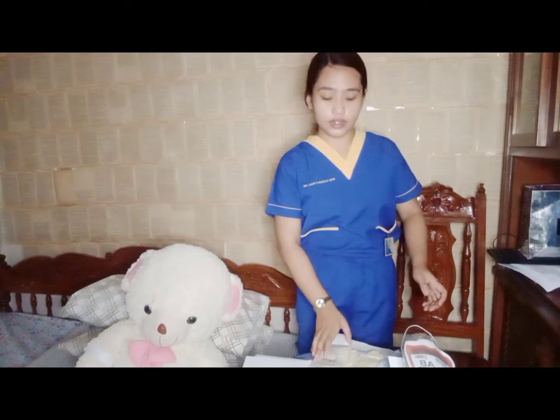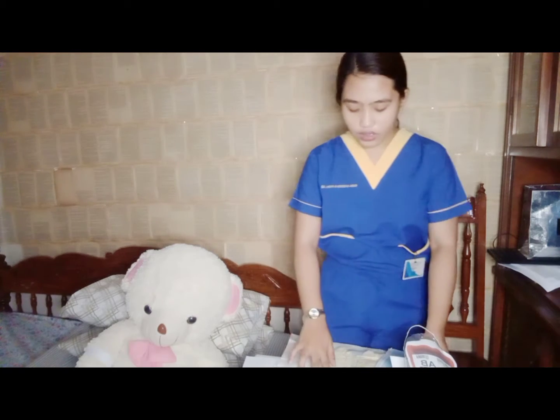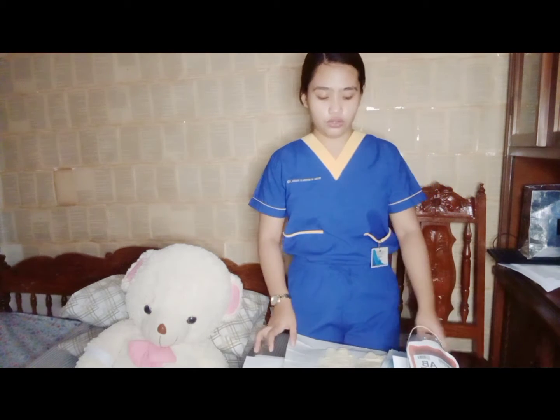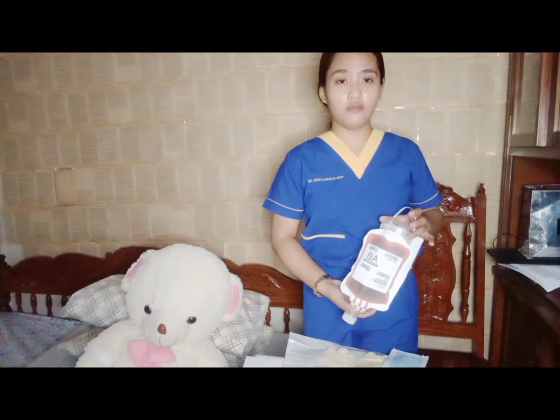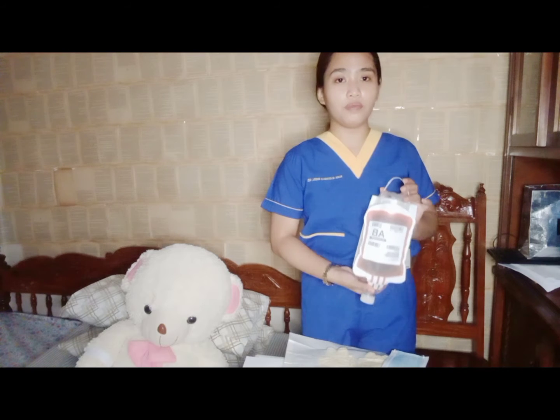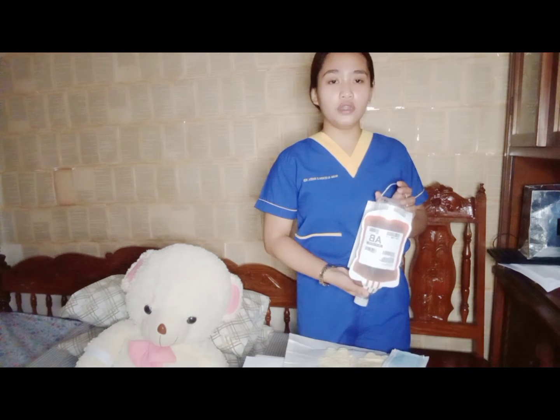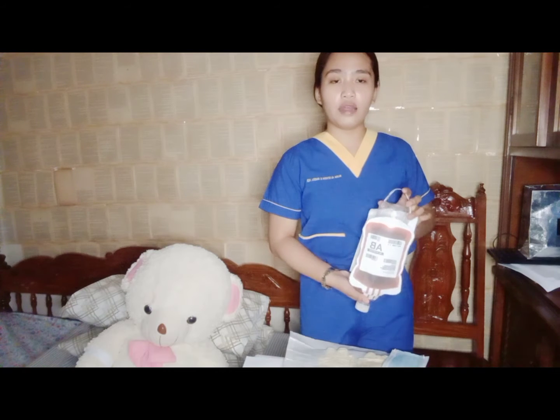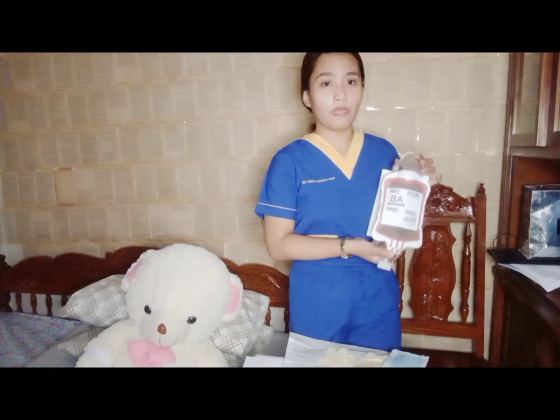Then, after checking the medical order, we need to gather the equipment needed for the procedure and place it at the bedside table. So, here are the equipment needed for the procedure. This is our blood product, which is obtained from the blood bank. The transfusion must begin within 30 minutes if the blood product is obtained from the blood bank.